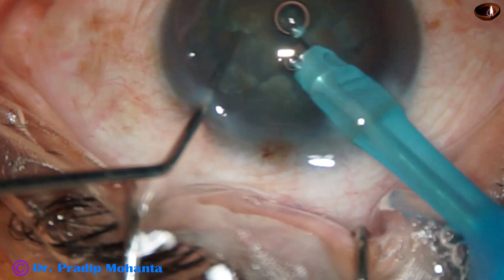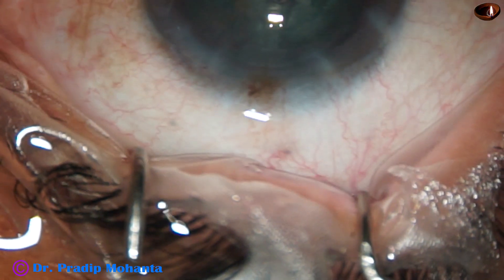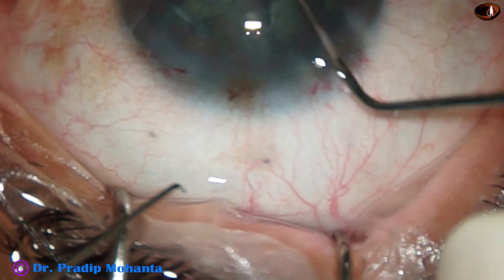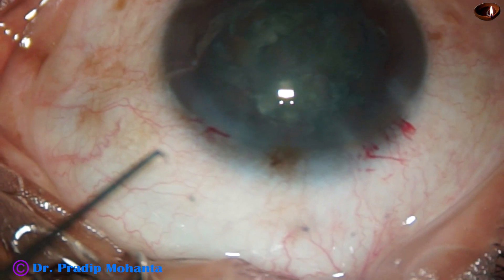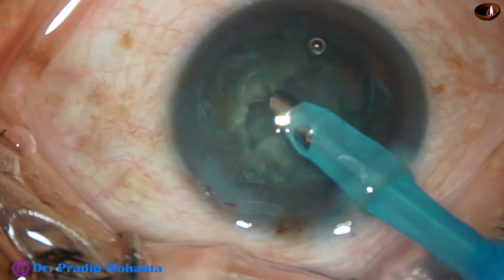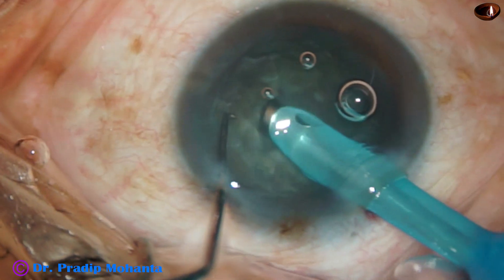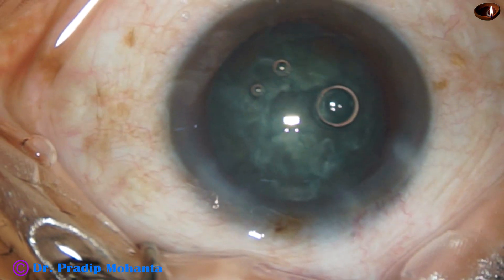It was just a central deep trench. Now I try to hold and made a chop, but it was not a complete through-and-through crack. I inject visco and try to prolapse the nucleus by rotation — it didn't happen. I go again, trying to hold the nucleus at another place and chop, but I find it dangerous. At this time I reduced the vacuum from 400 to 300, but still I could not hold the lens mass.